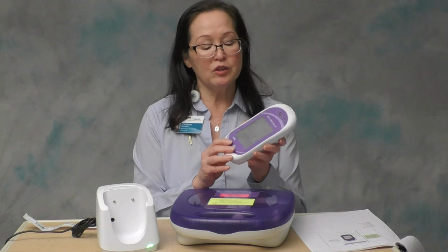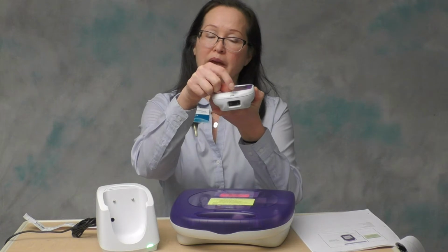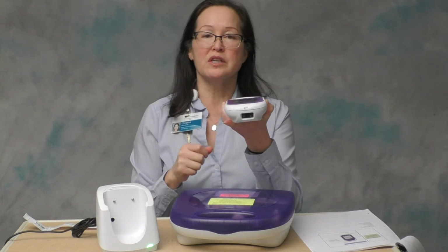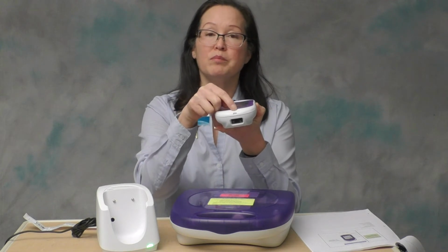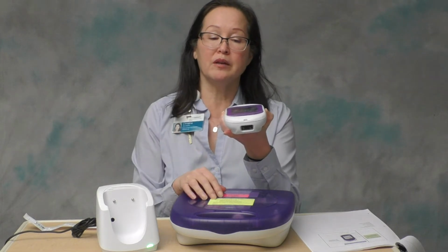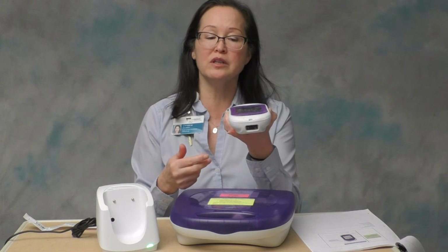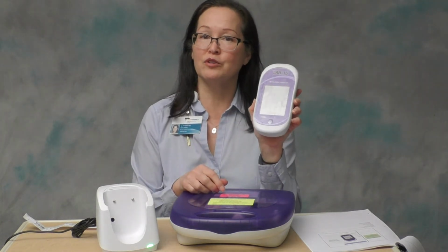The parts of the meter that you need to be aware of are the test strip port, which is at the top, and it is the little slit where the reagent test strip gets inserted. It's very important to ensure that this test strip port remains dry at all times. If it becomes contaminated with any fluid, such as QC solution, blood, or cleaning solution, it can ruin the instrument, and these instruments cost $700 a piece.